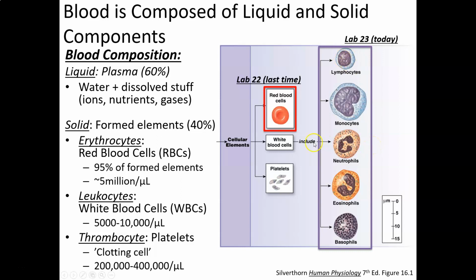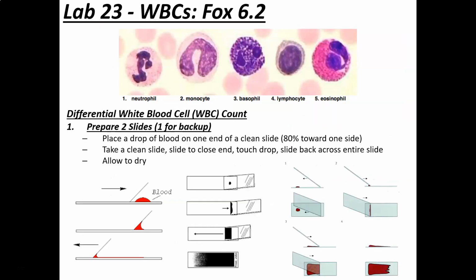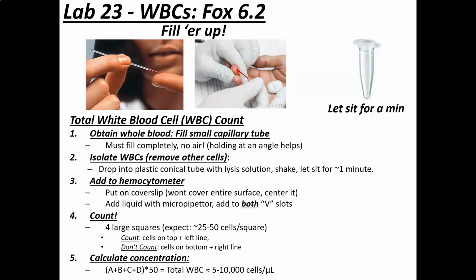So we can divide up the white cells, or the leukocytes, into two groups. The ones that have granules, those are called the granulocytes. Notice all of the granulocytes, neutrophils, eosinophils, basophils, all end with the last name phil. So that's what they have in common. The agranulocytes, A meaning without, end in cytes. We have monocytes and we have lymphocytes. So there's two of those. And they're going to be important to be able to tell the difference between each one when we do the experiment. We'll come back to that. So I just want to make sure we have those pictures.